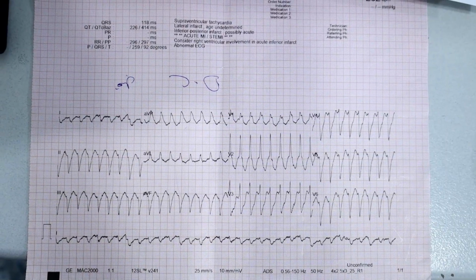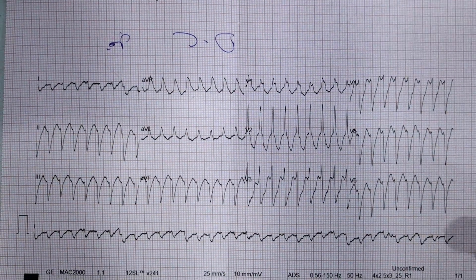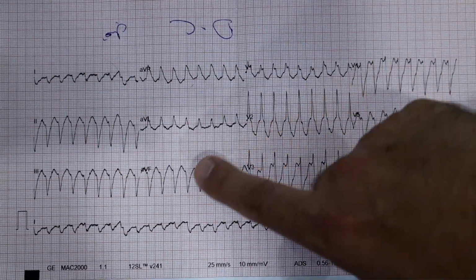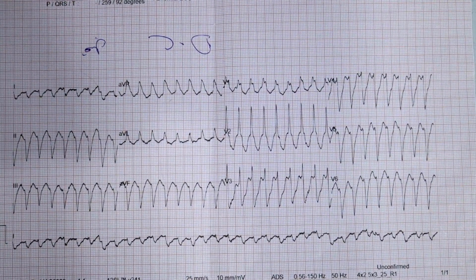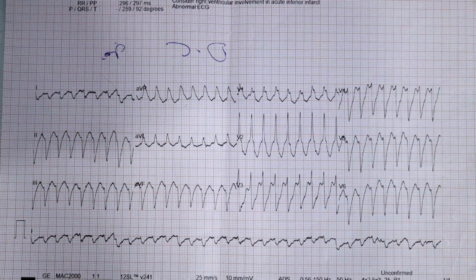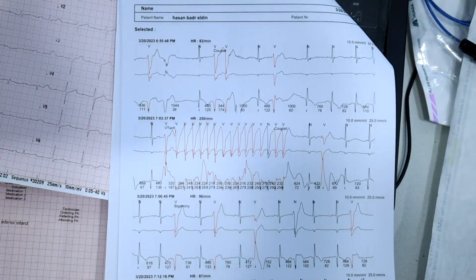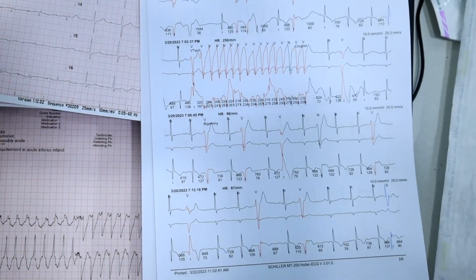Thank you. This is the clinical ECG of the clinical VT. We could see that it is arising from the LV. The transition is at V3, V4, and the axis is superior, so the origin of such tachycardia is the mid-segment of the lateral wall, which was verified by the CARTO substrate mapping. We could see that it was a very rapid tachycardia with a heart rate of about 230 to 240, causing syncope for the patient.